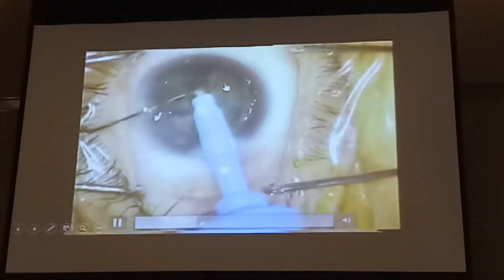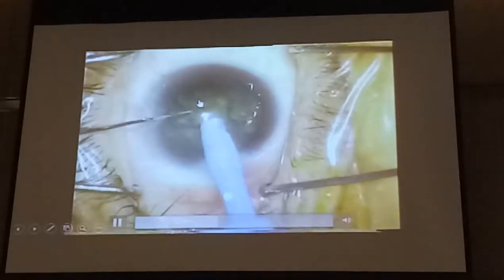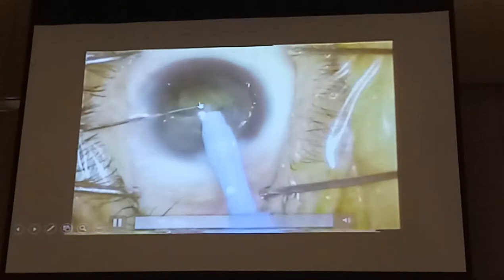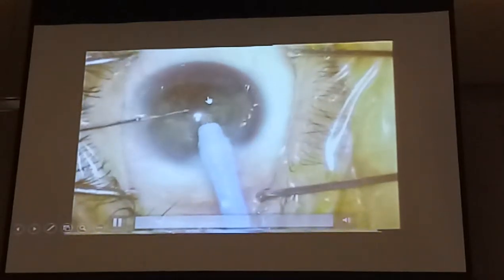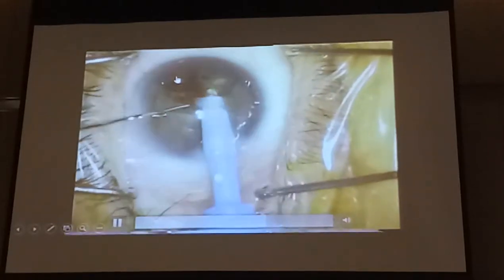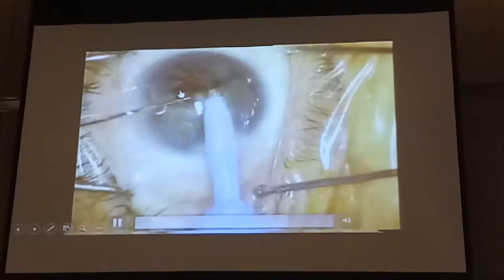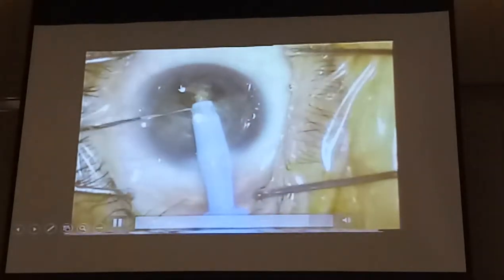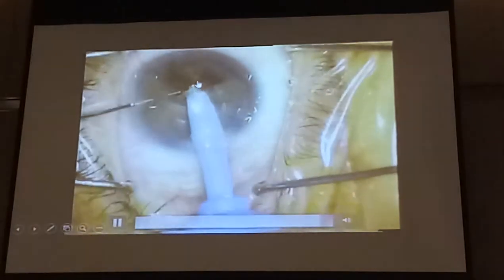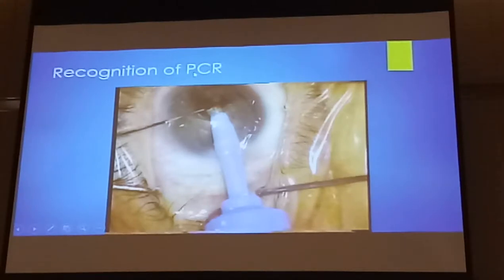So, we're looking at a very soft nucleus. It still seems okay. And then can you see something fluttering at the back here? Look at this fragment — after a while it jiggles. And then what do you see? The fluttering ends — the fragment has disappeared. This gap is widening and it's extremely clear. Did you see that? It flew back through that hole. Okay, that's already late — when you drop a small fragment.